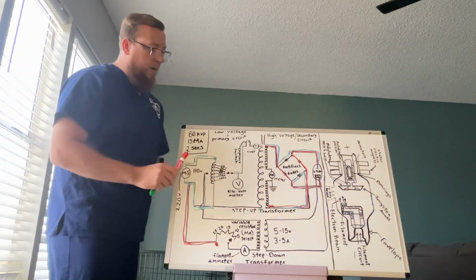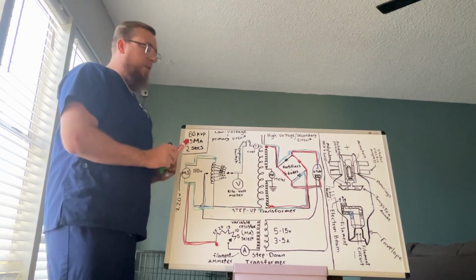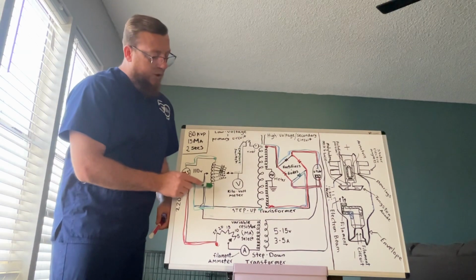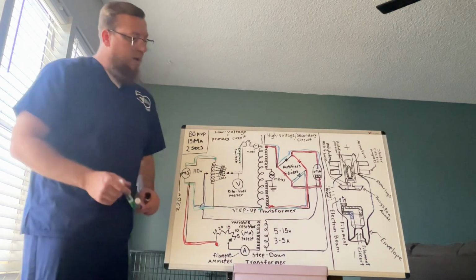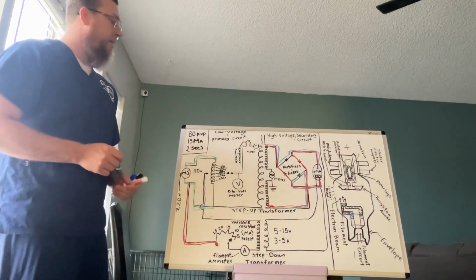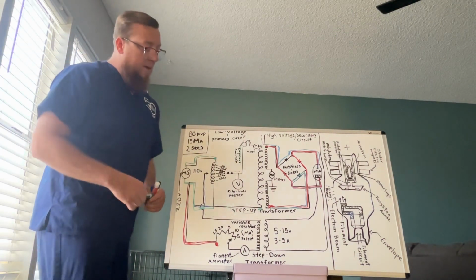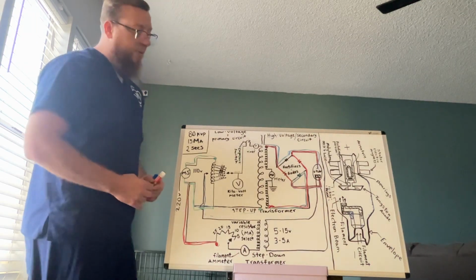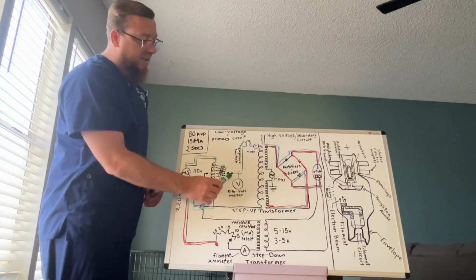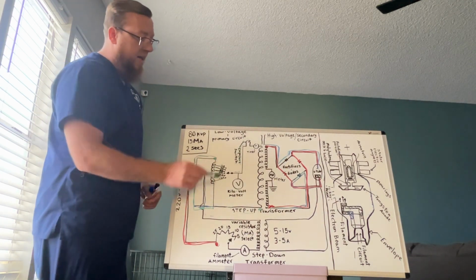Now at this point, I already entered my 80 kVp, my 15 mA, and my 2 seconds on my control panel. This very first point is an auto transformer for our kVp, so once I select that and I put the 80 kVp on my control panel, this kilovolt meter is going to read that I put 80 kVp in my control panel. It's going to send this dial to the correct number of kVp that I selected, which is going to be at 80.